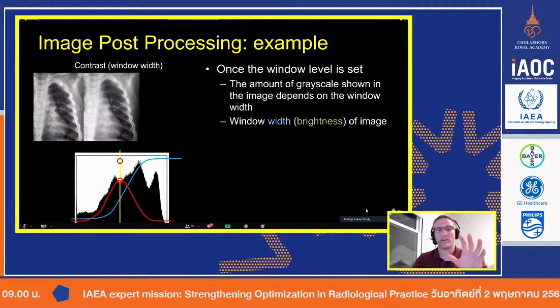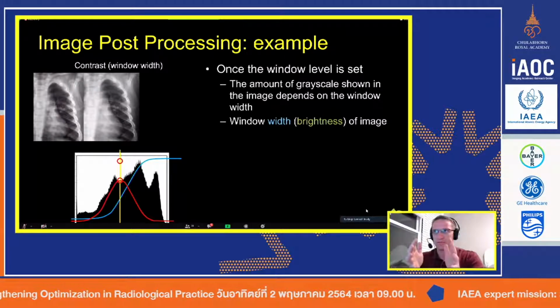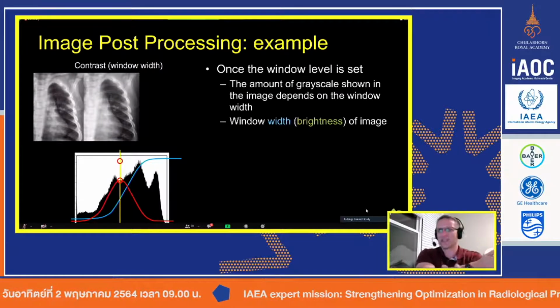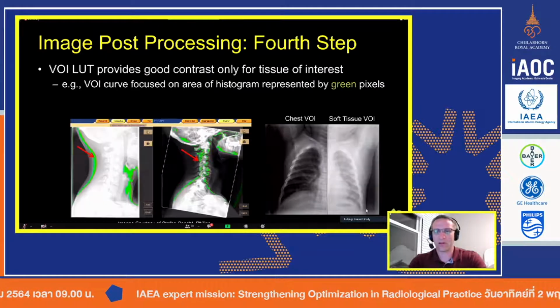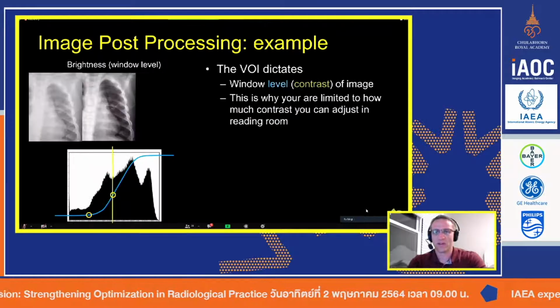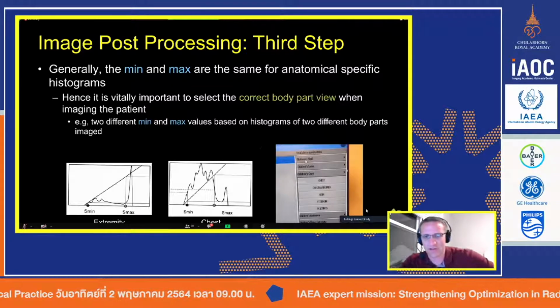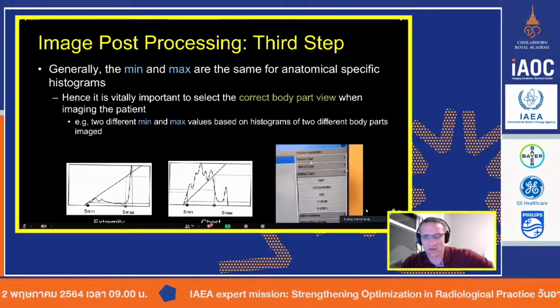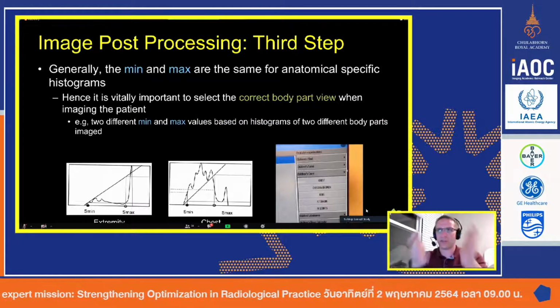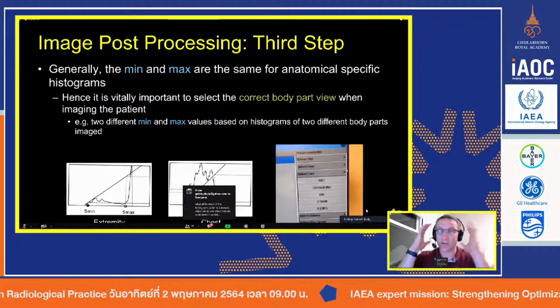Now, you also asked at the very beginning of your question, all of this happens at the console before they send it over to the PACS. If you, the radiologist, are looking at this on PACS and say, this just doesn't look that good, you can call them up if you have the time and the ability and say, hey, something doesn't look right, can you reprocess that? The first thing is, if they accidentally, over here on this picture, were supposed to do a child's skull but clicked chest, it was just an accident, well, they can undo that. That's easy. All you have to do is pull the image back up, and instead of chest, push skull, and it'll reprocess everything. And if it really was a skull, it'll look so much better.